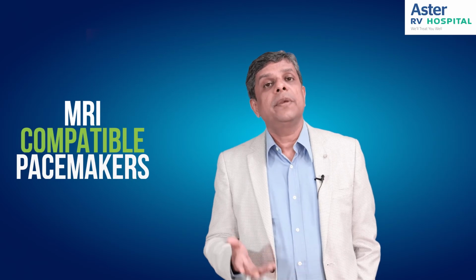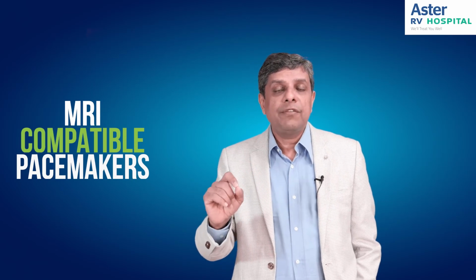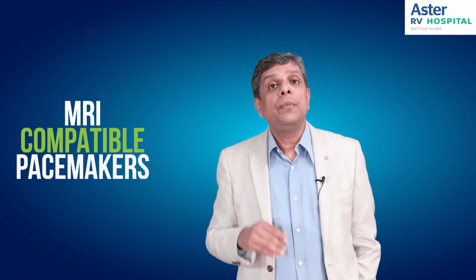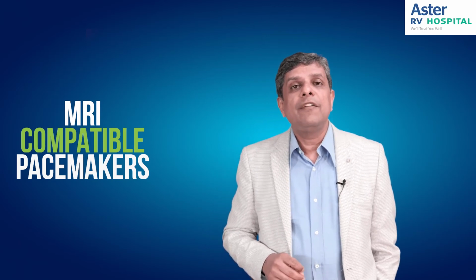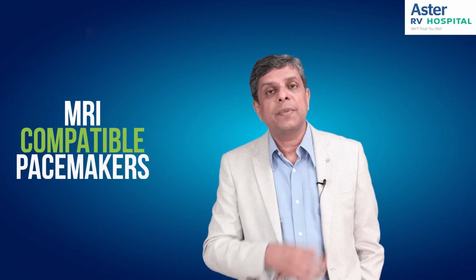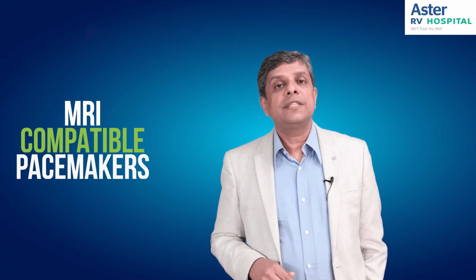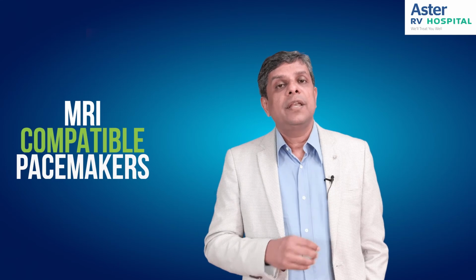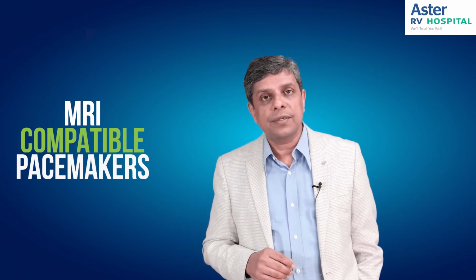We all know that pacemaker related problems happen in the elderly, and above 65 years of age, almost one third of all people will require some kind of MRI in their lifetime. So it will not be a great idea to deny MRI scanning just because of a pacemaker, and therefore these MRI compatible pacemakers have been developed. So now the state of the art is MRI compatible pacemakers. Once the pacemaker is implanted, the patient can still go and have an MRI if for some reason it is needed in the future.